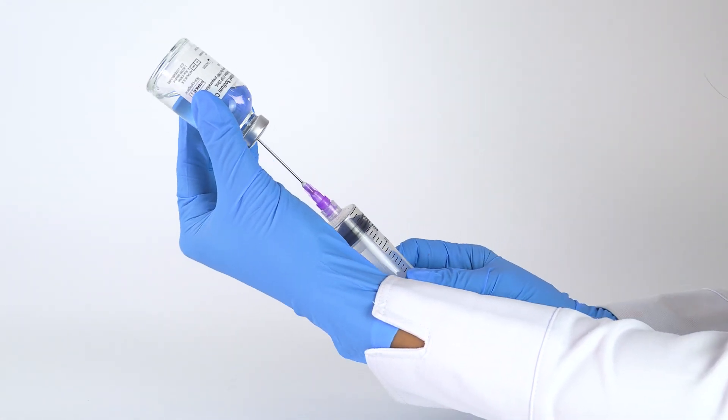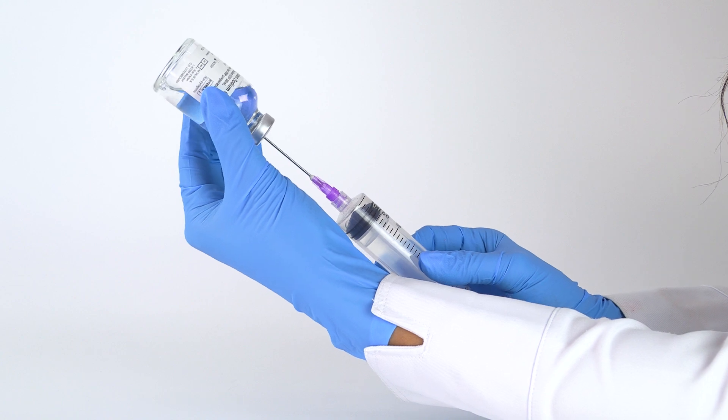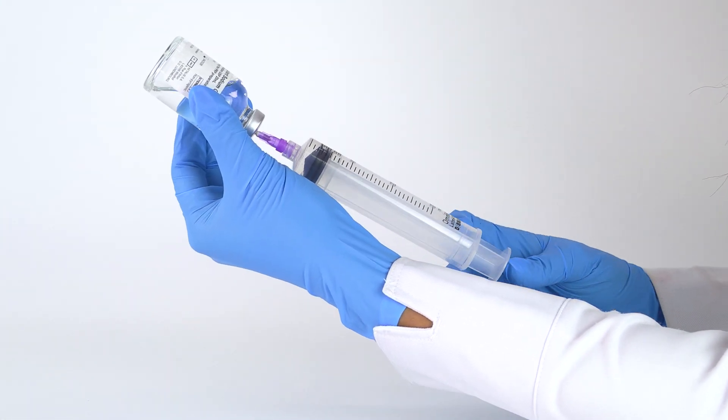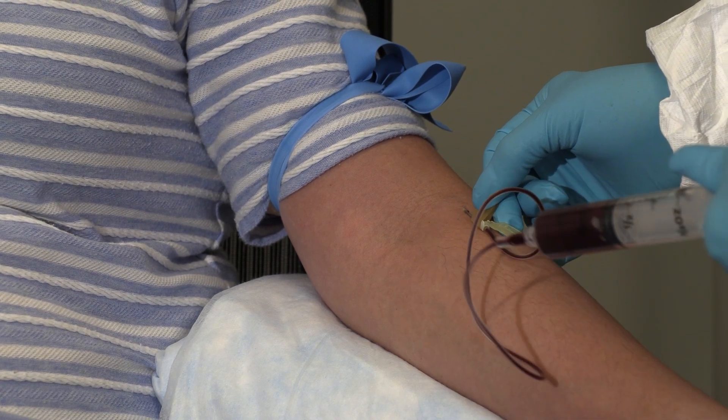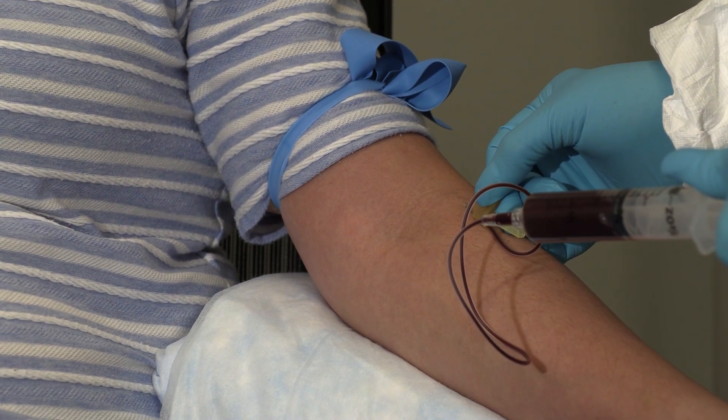Fill a 30 milliliter sterile syringe with 3 milliliters of citrate anticoagulant. Then draw 27 milliliters of blood from the patient, filling the syringe to 30 milliliters.